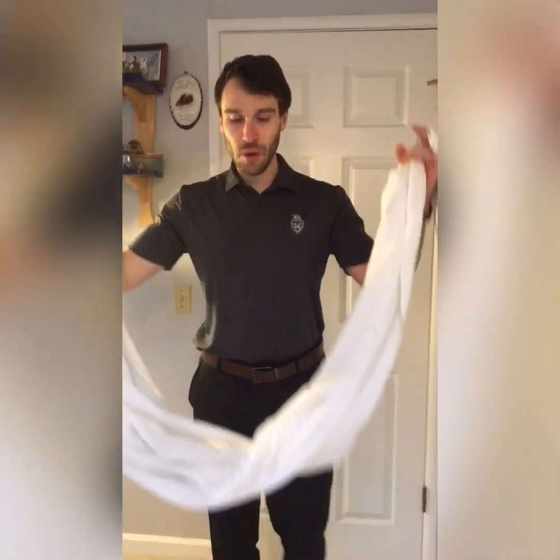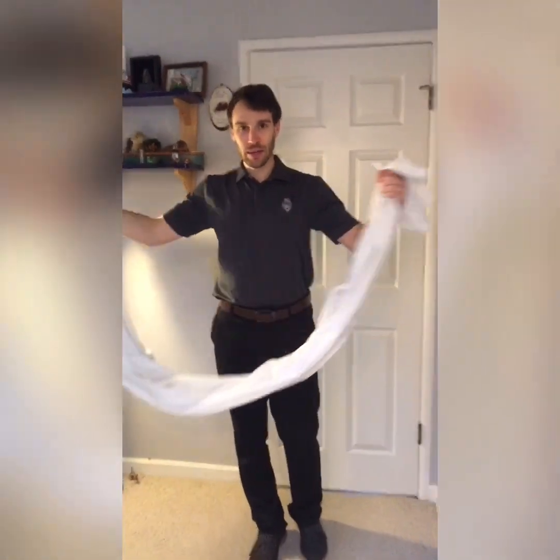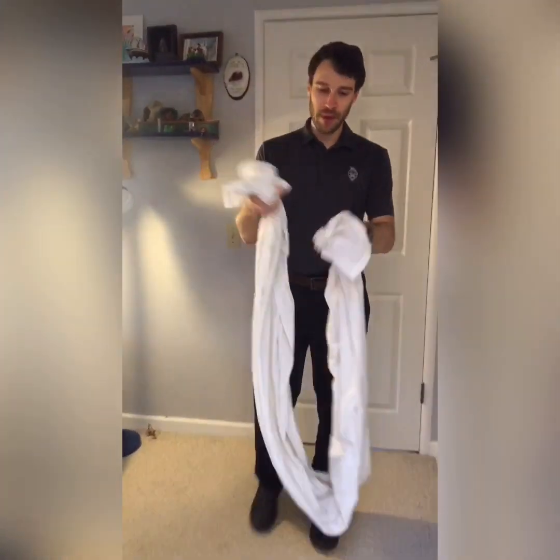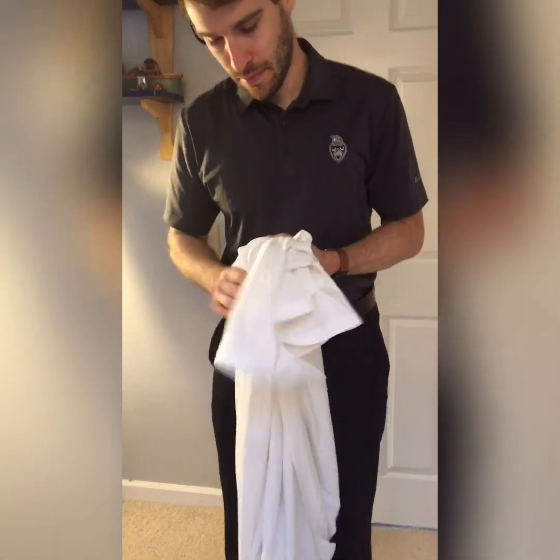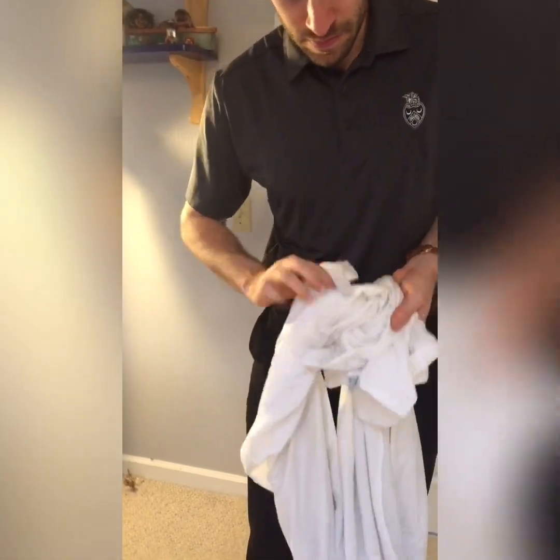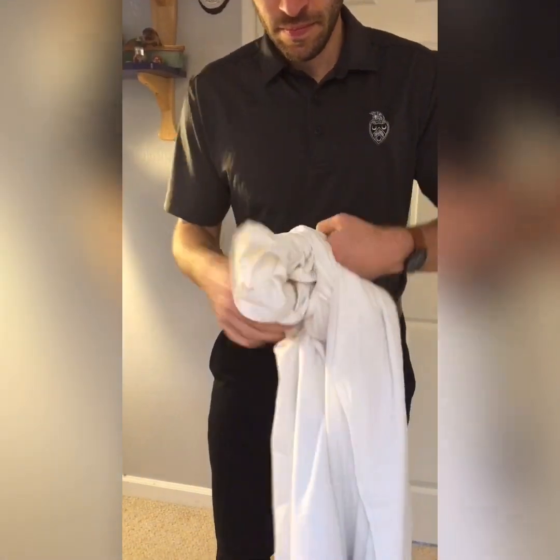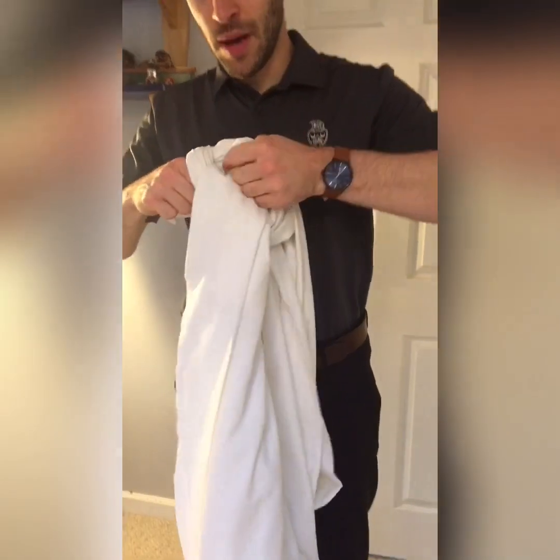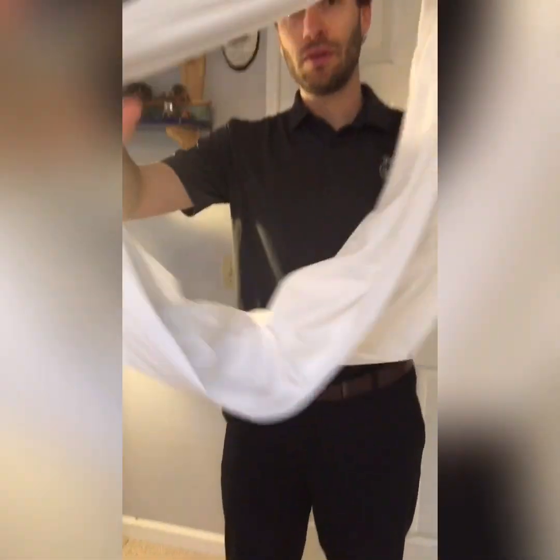So first, we're going to take our first twin bed sheet and roll it up lengthwise, and we have a lot of space between. Take the 2 ends of the bed sheet and tie a small knot there. Your knot should be small enough so that you have enough ends on either side to make a circle that's about this big.